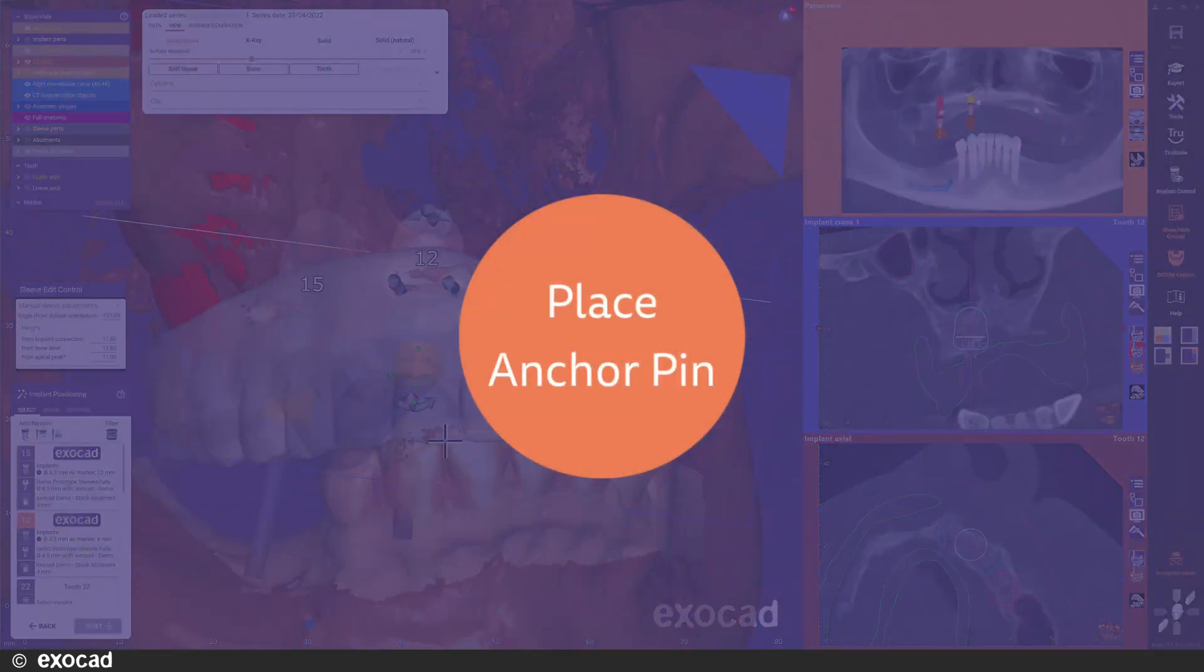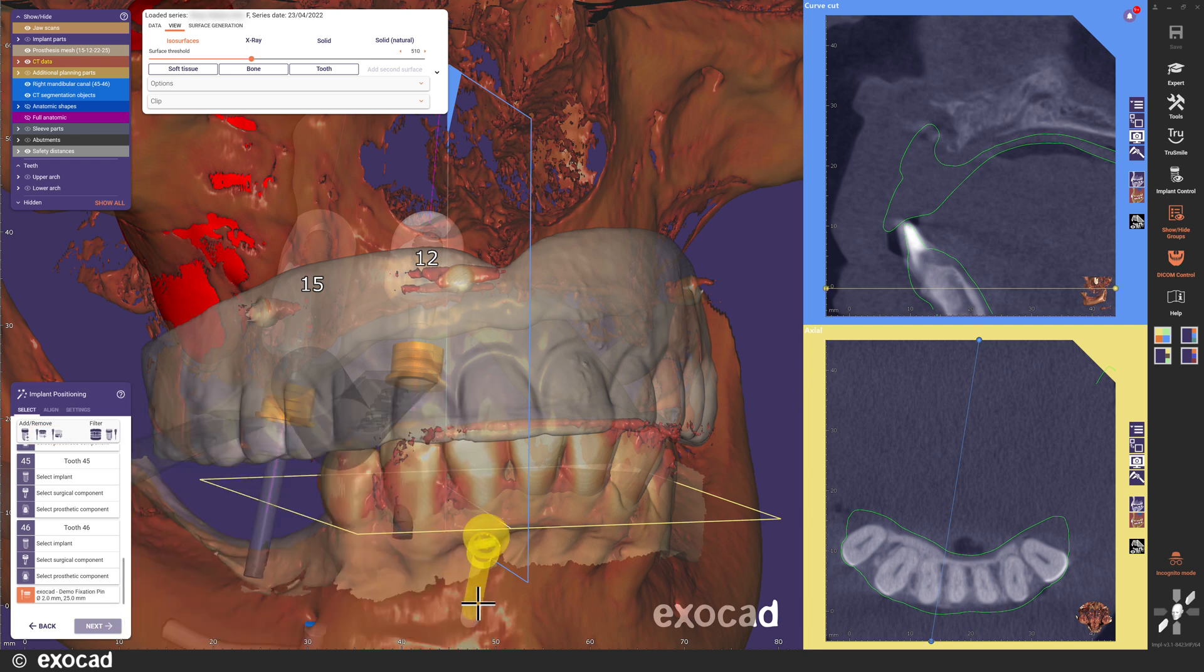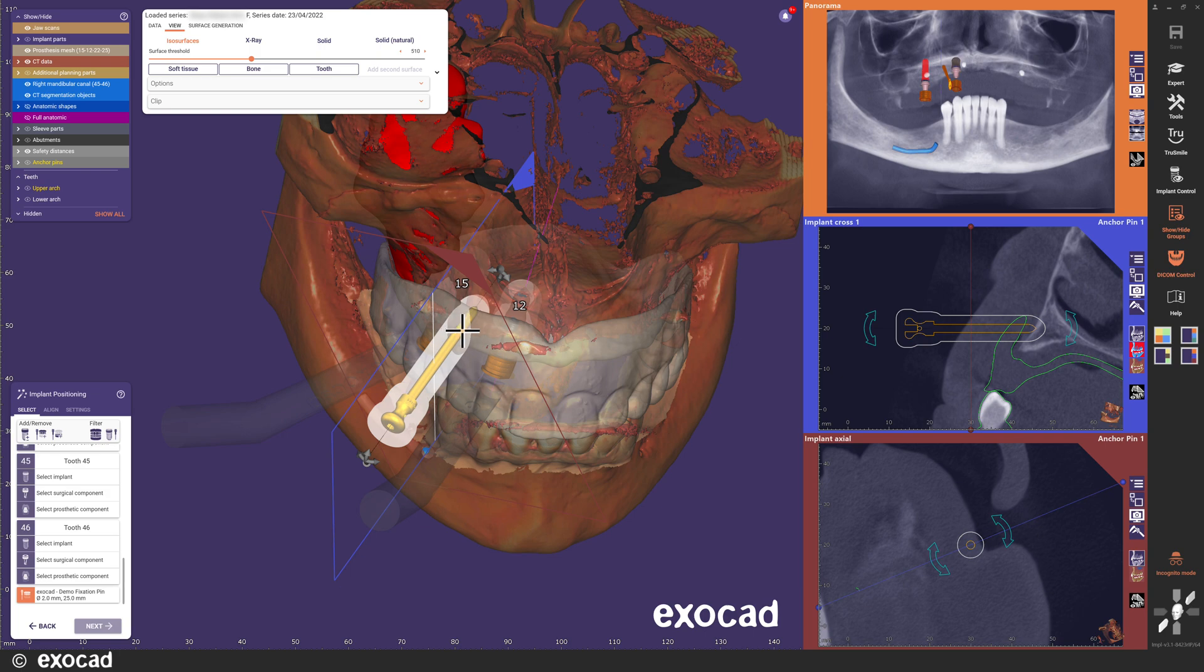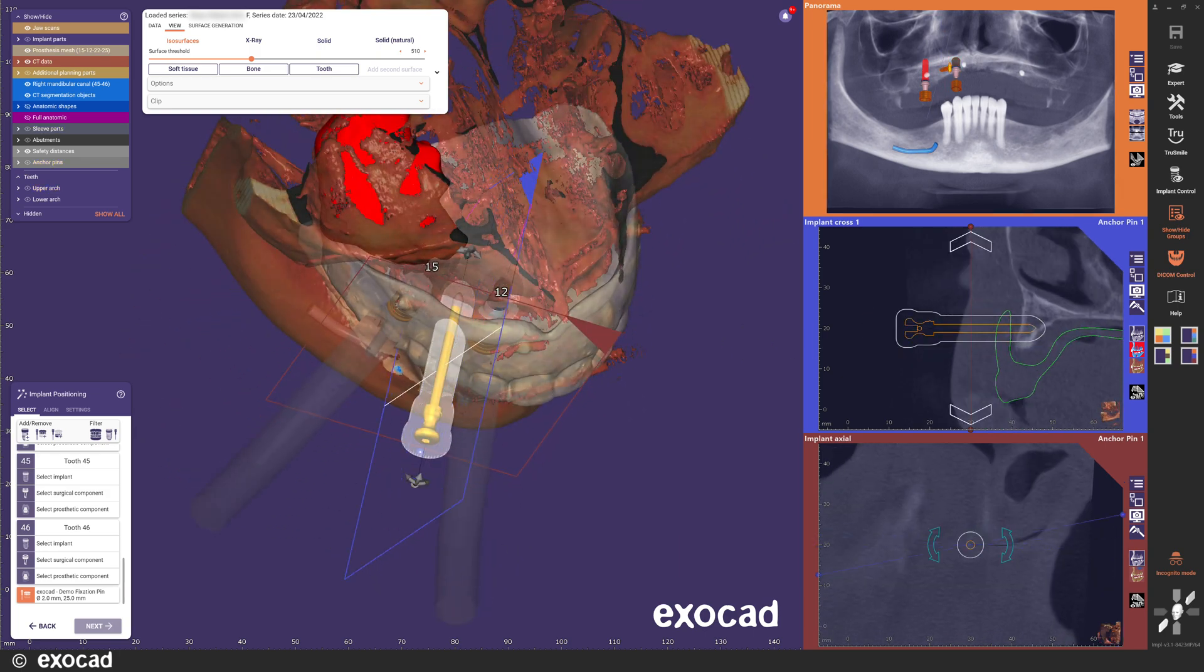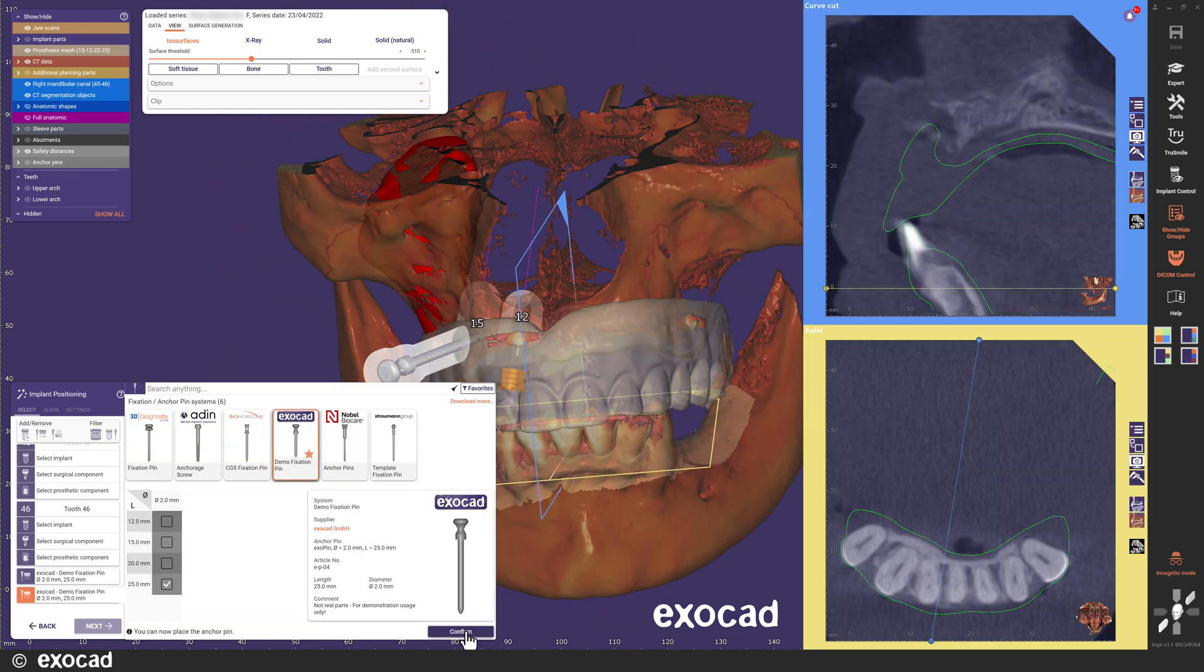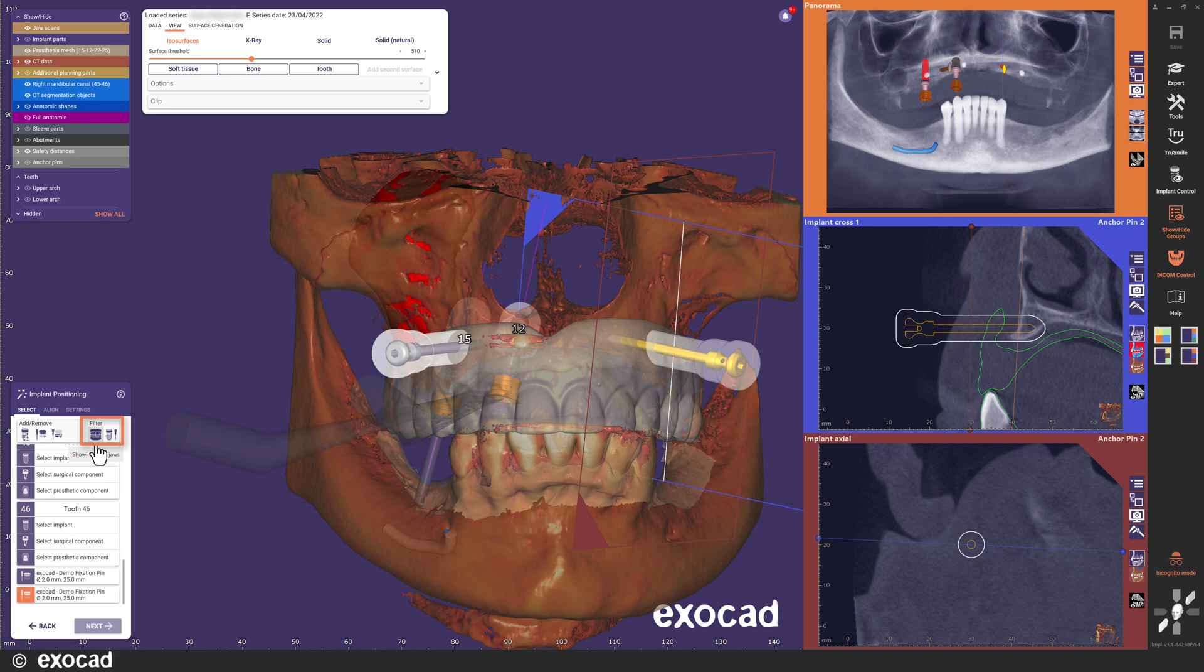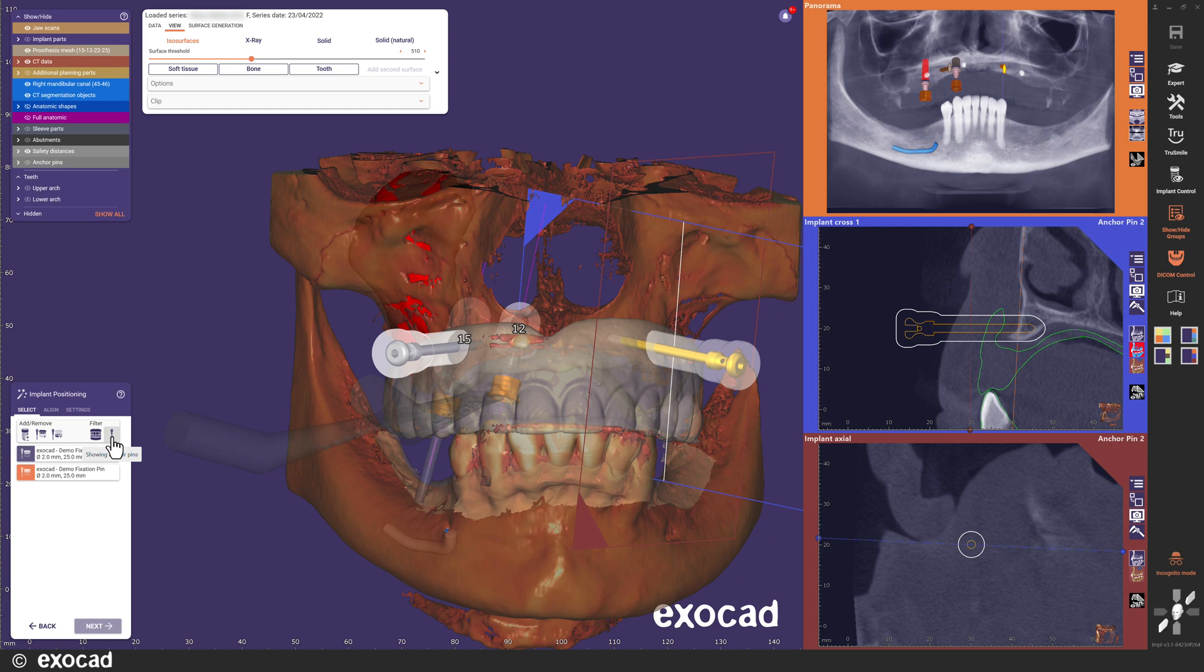To place an anchor pin, click the anchor pin button for the jaw you want to place the anchor pin in. The selection dialog opens and you can select which one you want. The anchor pin selection does not depend on which implant you might have placed already. You can choose from all your installed anchor pin libraries. On the right side we have filter buttons to filter the list. Select to show only upper jaw or lower jaw or both. Select to show only implant, anchor pins or both.